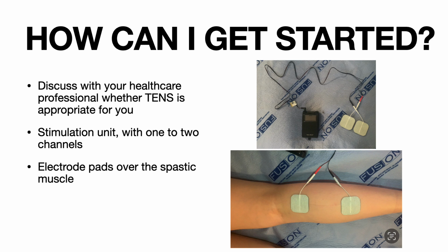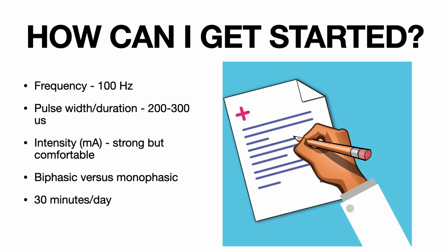So again, talk to your healthcare provider to determine what muscles are spastic, what spastic muscles are most problematic, and where you should apply these pads. Often over the muscle, you should have these pads separated by at least an inch, as shown by the image here.